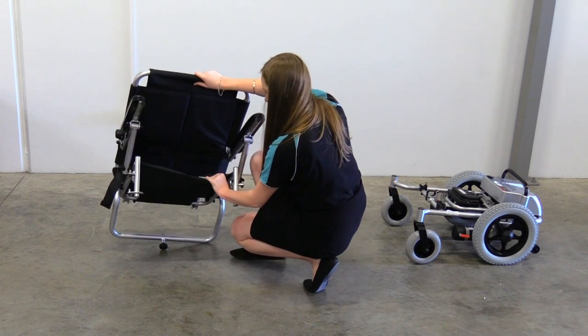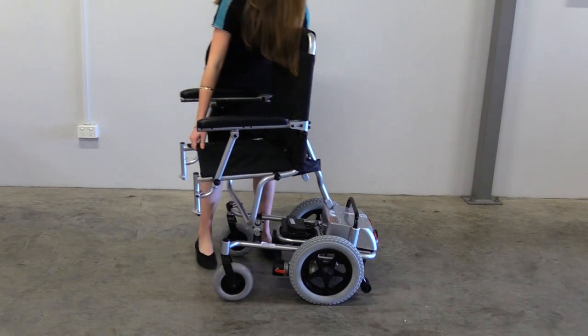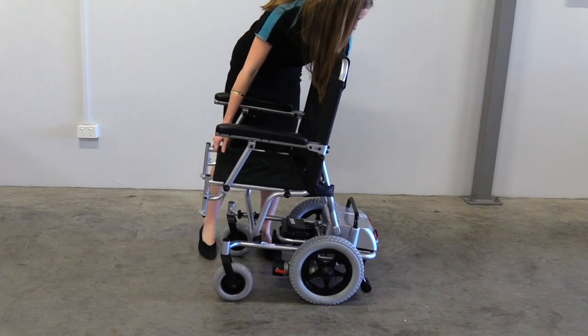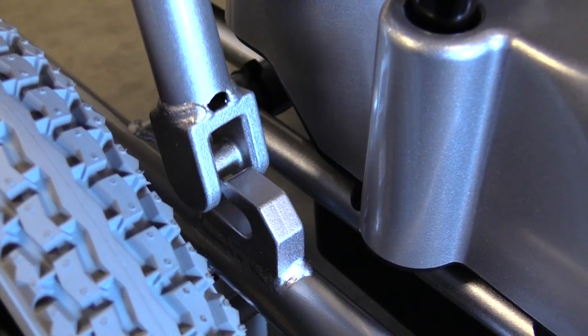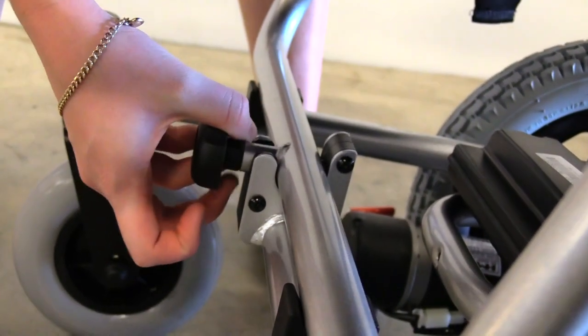Next, you will need to unfold the seat. To attach your seat, line the bottom up with the connection points and slide the saddle set in. Pull the pin lock out and push the seat down, then lock it in.